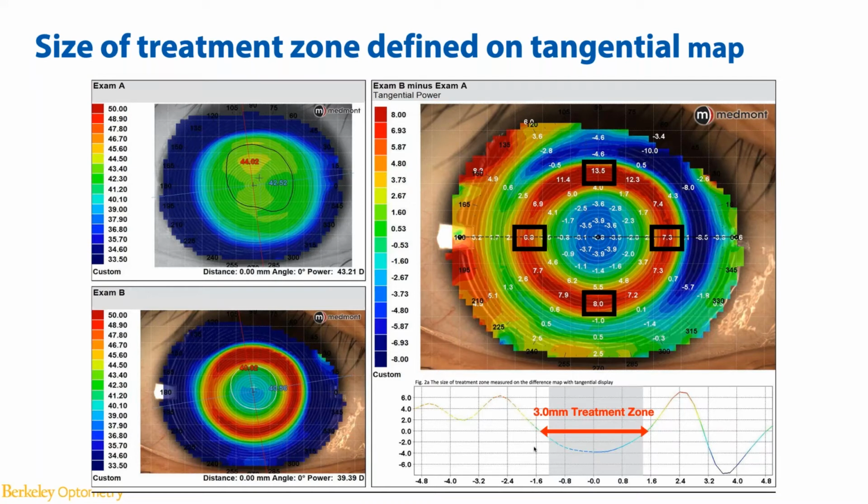So it's a very dramatic difference depending on which display environment you use in analyzing the data. For this study it is less concerning because we're comparing the same subject, same eye, two different designs. As long as we're using a consistent display for the analysis, it still shows a pretty valid comparison.